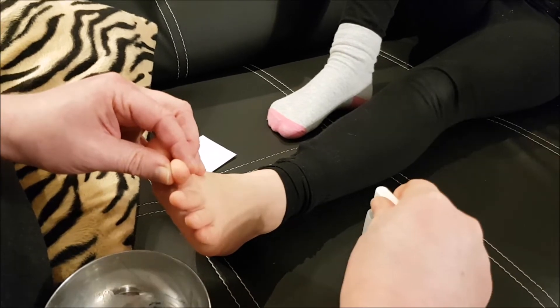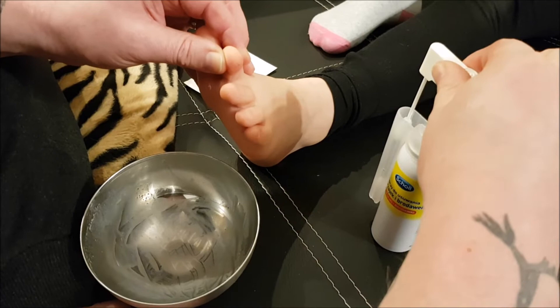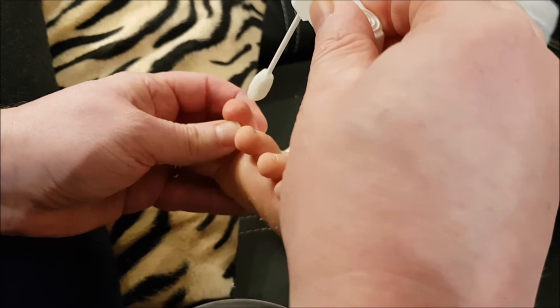Put it there for 15 seconds. Now I can take it out, and we need to freeze it — we need to now touch it for 40 seconds.